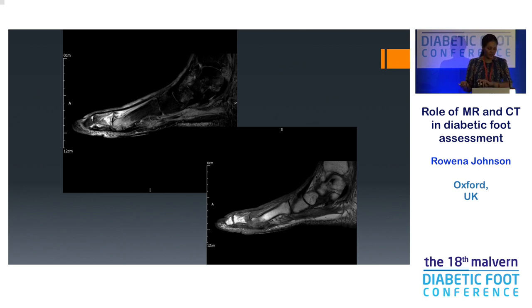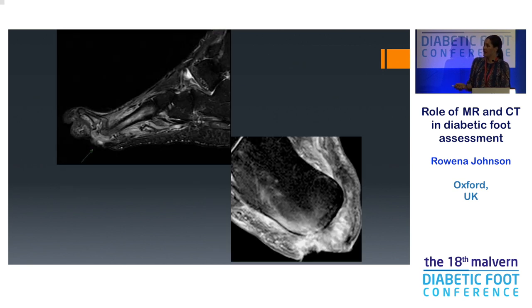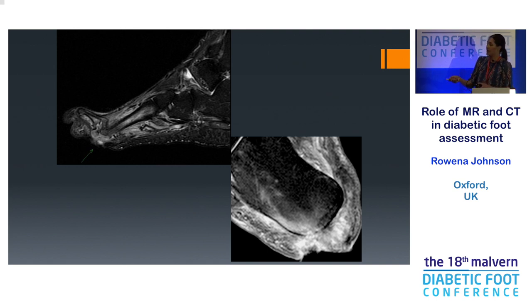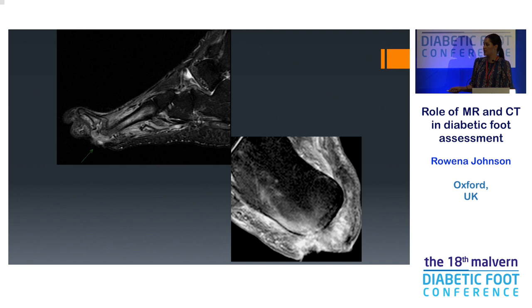You can also see the ulcer at the plantar aspect of the foot beautifully on these images. This is another example showing destruction of the joint or reactive inflammation, and here the calcaneus with all that soft tissue inflammation. Looking at the cortex — on MRI it's black — you think: could I trace it with a pencil all the way around? You can trace it, and then it just disappears — that's where you have cortical erosion. And you can see the large ulcer at the heel.